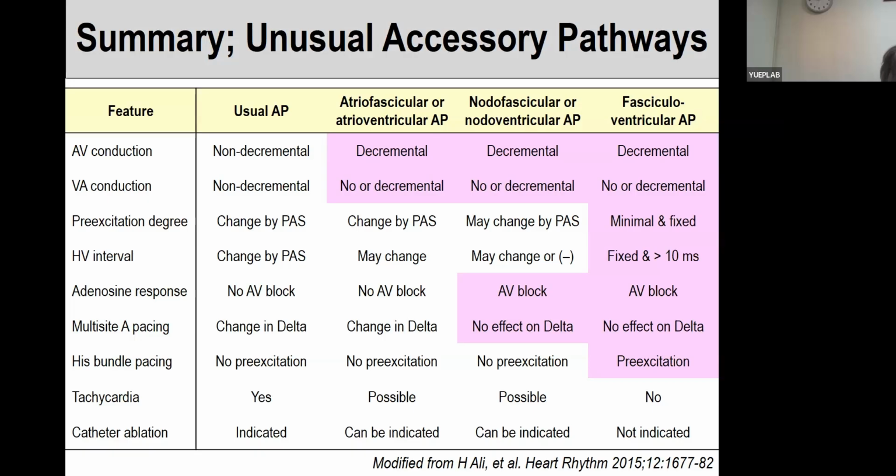And I advise you to use the softest catheter possible, not the contact sensor, all this 3D business, because that actually is the worst because you end up bumping. Because the electrodes are smaller, their recording potential is not that great. You don't find that distinctive, like a node-like potential.